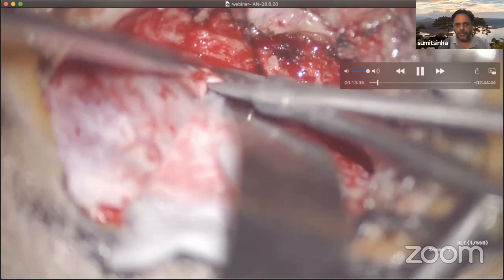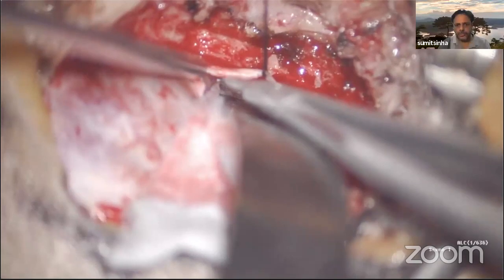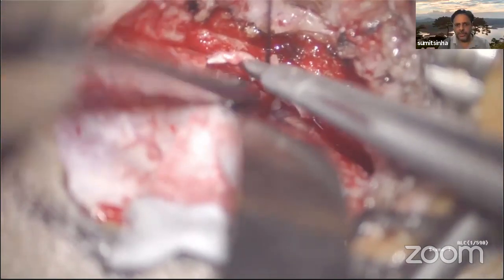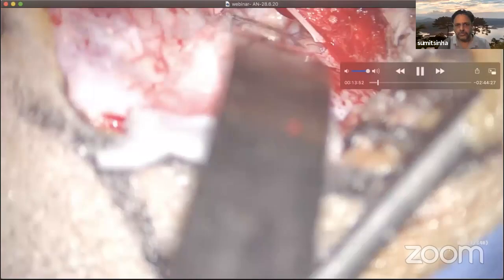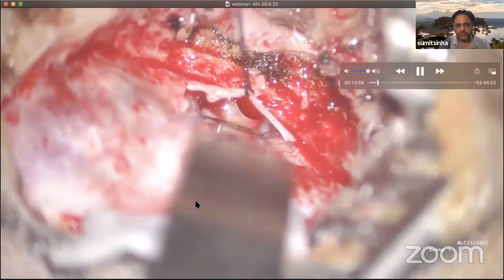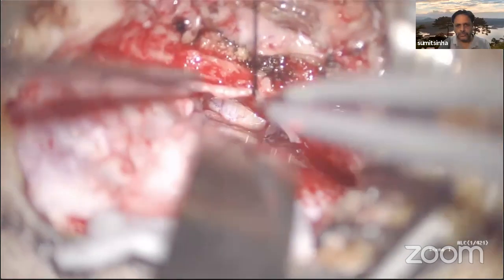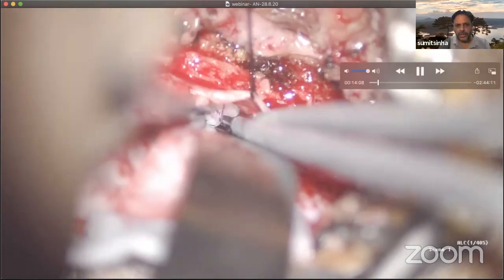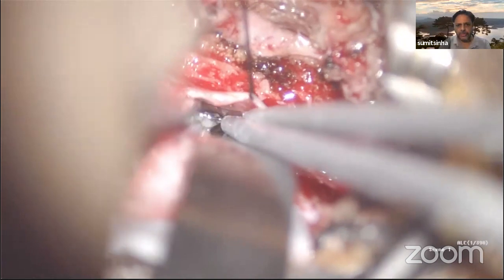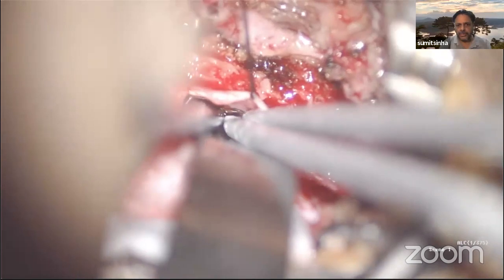Cutting more of the dural flap. This is the lateral cerebellomedullary cistern I am about to approach. Now you see that the CSF will come, a gush of CSF will come. So this is the lateral CSF coming out from the lateral cerebellomedullary cistern. And then you communicate the cistern with the cisterna magna medially, and your job is done.